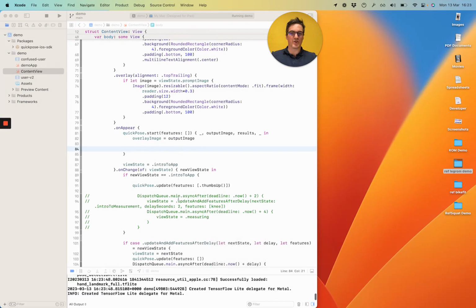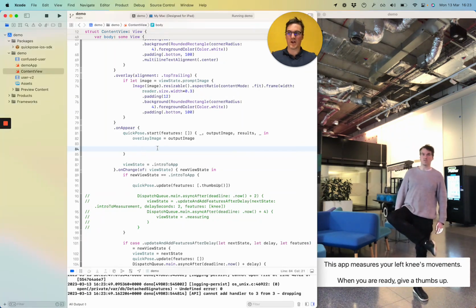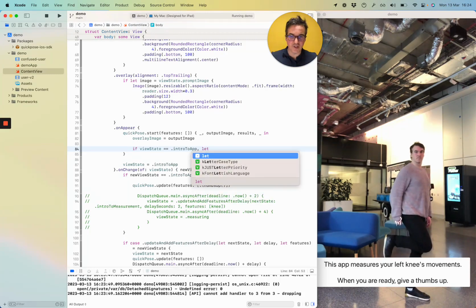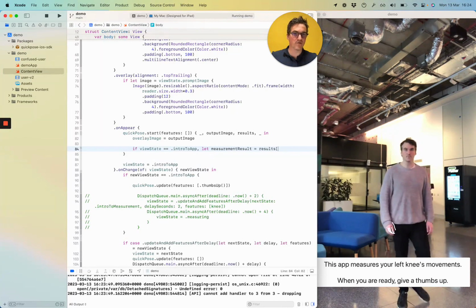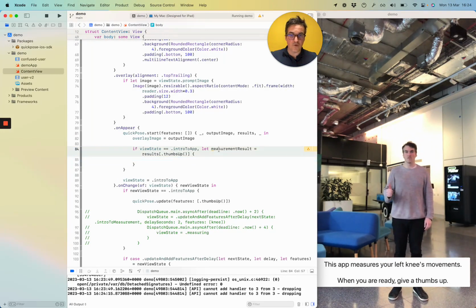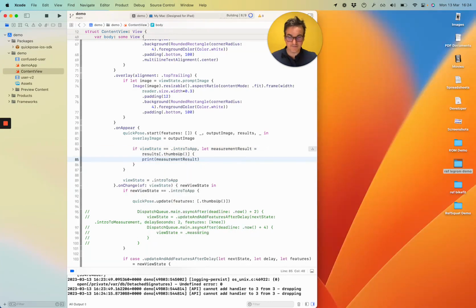And then we want the thumbs up to determine whether it goes from intro to app onwards. So now it's just stuck in intro to app. Now we're going to change that logic. So if the view state is equal to intro to app, and the features I get, measurement result equals, now we're pulling this out of the results dictionary, and we use the thumbs up feature as our key. We've got measurement result thumbs up. We're not using that yet, of course. I'm just going to print the measurement result now so you can see it. I'll just print the whole thing.